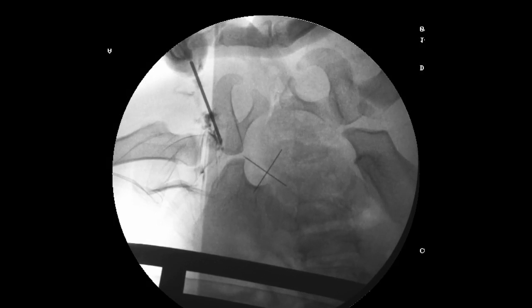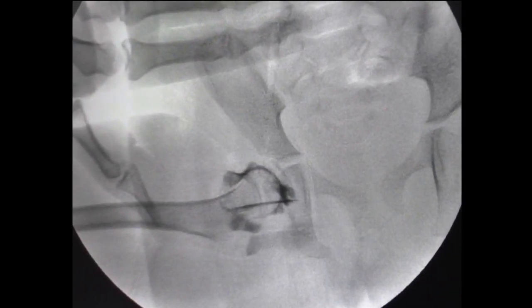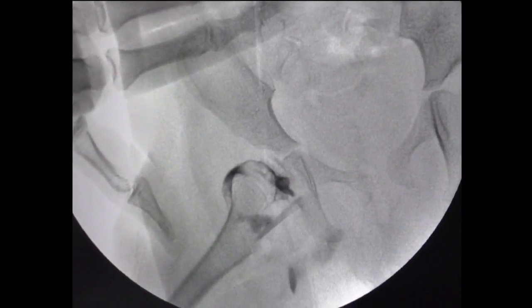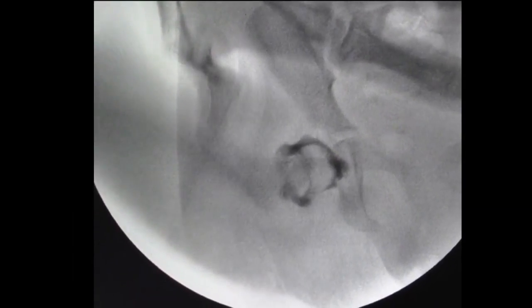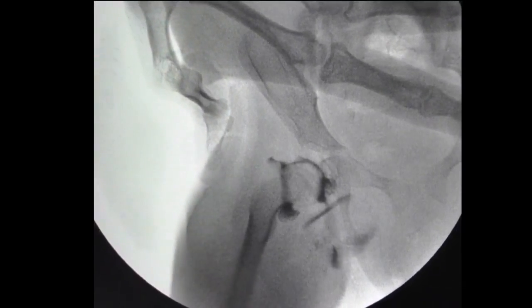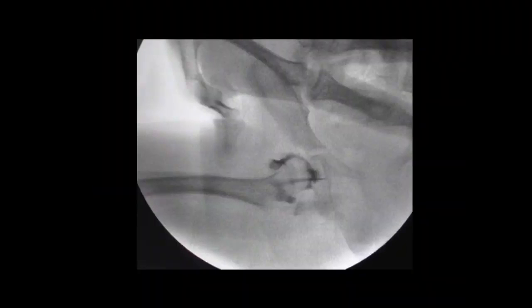Now you are ready to inject the dye — I use Omnipaque. Then you take the hip again, checking the safe zone of Ramse. You abduct so that it is stable, and then gradually adduct to find out the point at which it dislocates. The medial pooling of the dye should be less than 2mm.